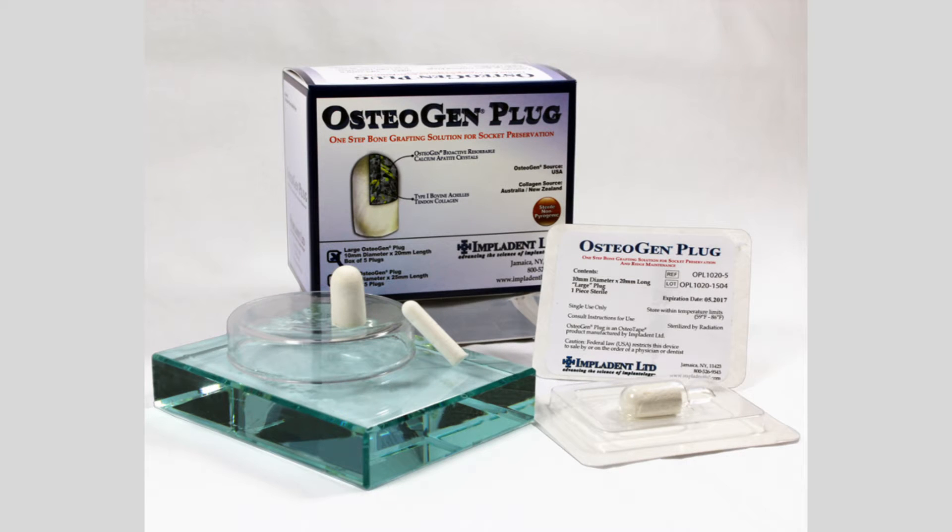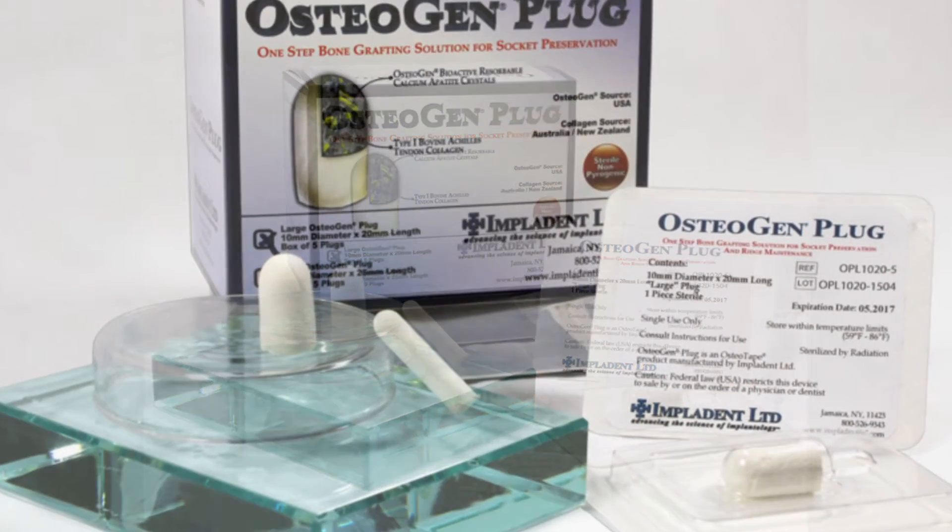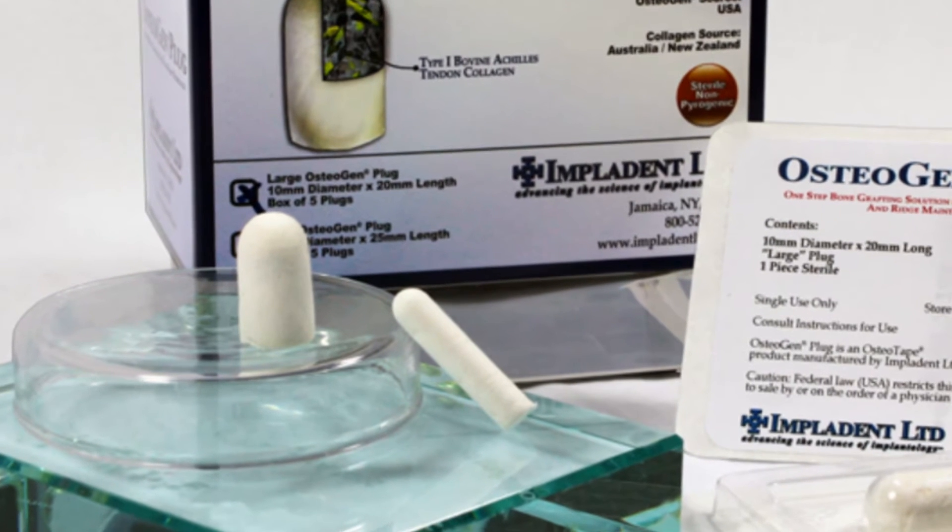Implident Limited is proud to introduce the Osteogen Bone Grafting Plug, the one-step bone graft for socket preservation and ridge maintenance. The idea behind the Osteogen Plug is simple. We take a standard collagen plug and fill it with our Osteogen Calcium Phosphate Bone Graft.